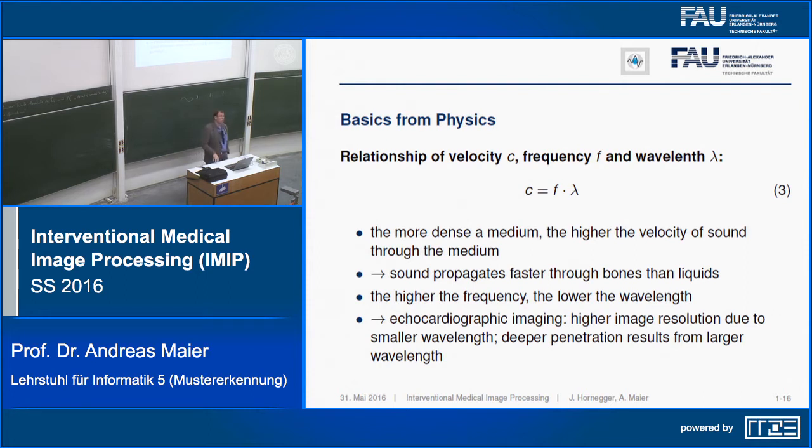So this is often the reason, and of course because your planes can be slanted, why people call the modality of ultrasound observer dependent, because it really depends on the skill. And if you have a very good skill, you can do very highly reproducible measures. But if you're an inexperienced user, you will select very different slices, which will then result in very noisy measurements with very, very high variance. Okay.